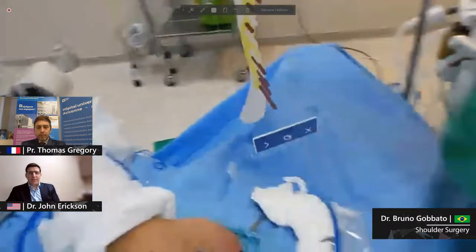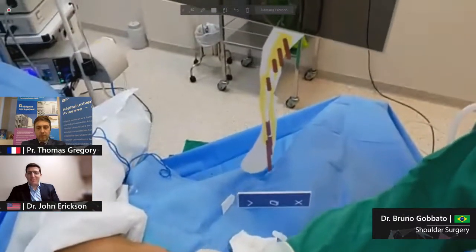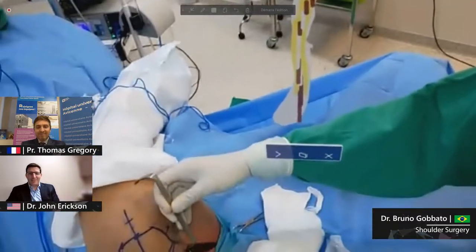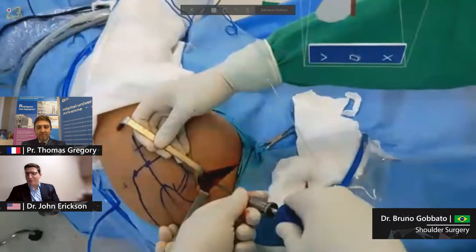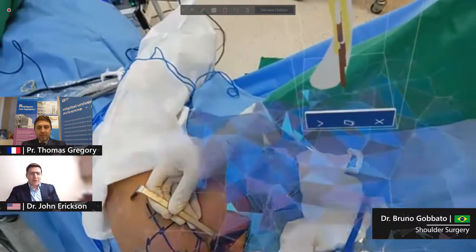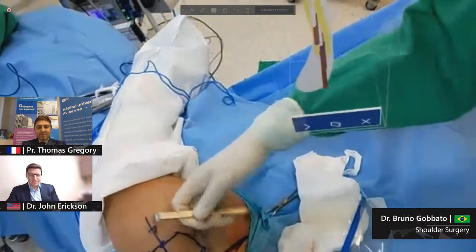I've been moving that direction myself for certain cases, and I did a Lacertus release the other day and had that amazing result on the table where the patient has power back in their hand. It's such an incredible experience. I don't have experience in the clavicle with it, much like Bruno, but I can attest that the more I've been using it, the more I like it, and the more patients seem to like it. So just something to consider, Bruno. It's a great technique in general.